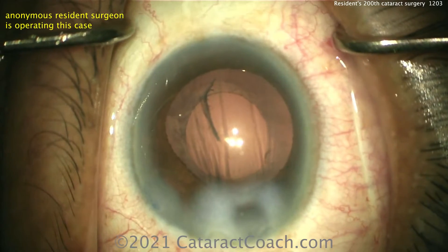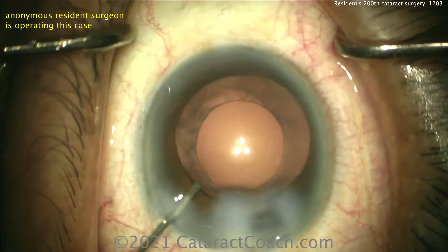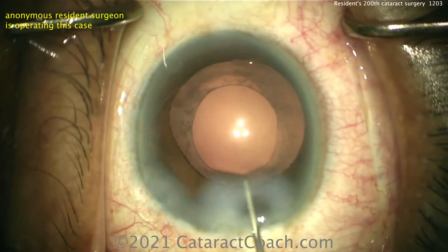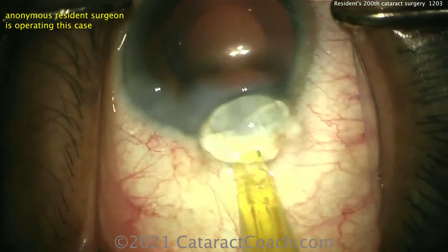You may want to polish up a little bit of the undersurface of that anterior capsular rim — you can see that haze there, that's residual lens material. Not critical to do so, certainly within your training it's not that important early on, but it is something to work toward.